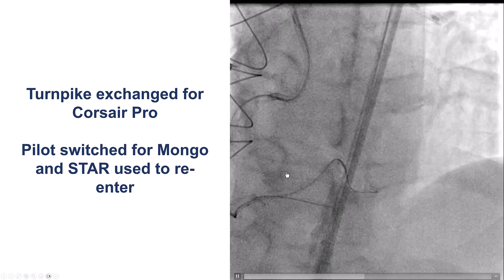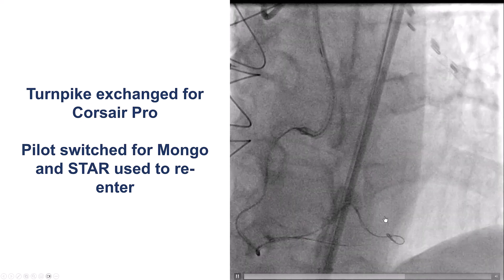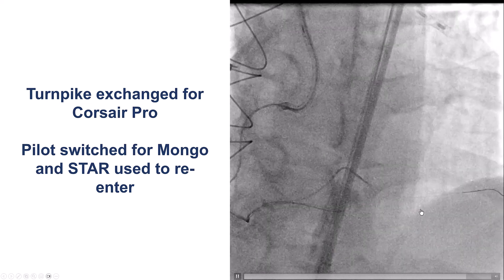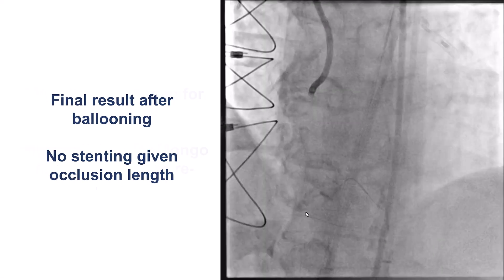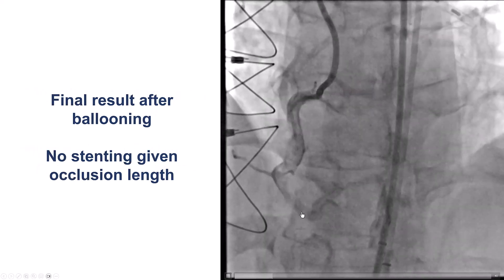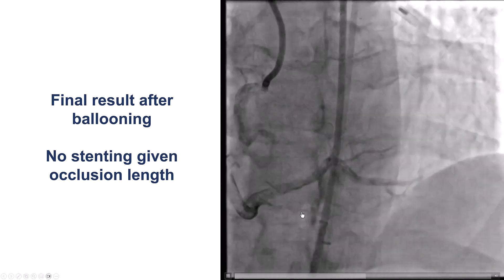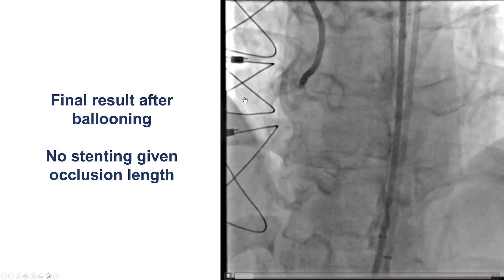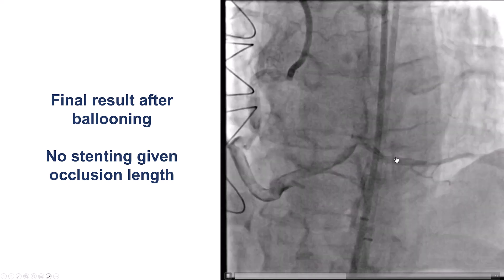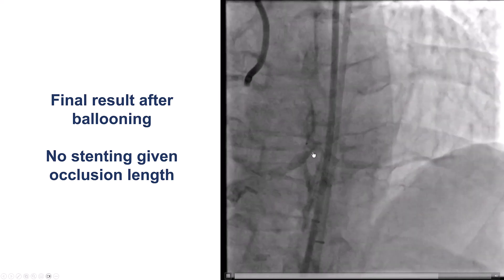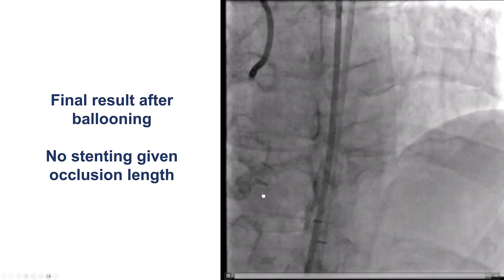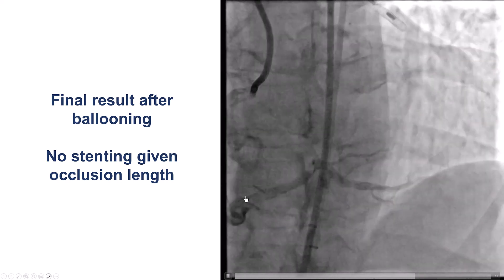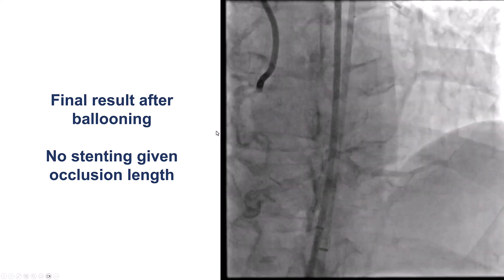We switched to a Mongo wire and then performed the STAR technique, advancing distally to restore some antegrade flow. This is how the vessel looked after balloon dilatation — there were extensive dissections throughout the vessel, but there was good flow distally, and we decided not to place a stent given the long occlusion length and the extensive dissection.